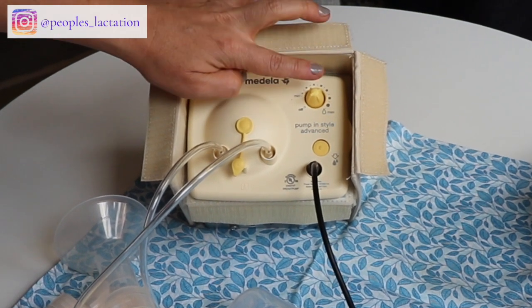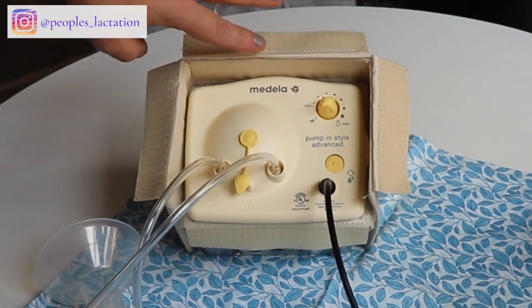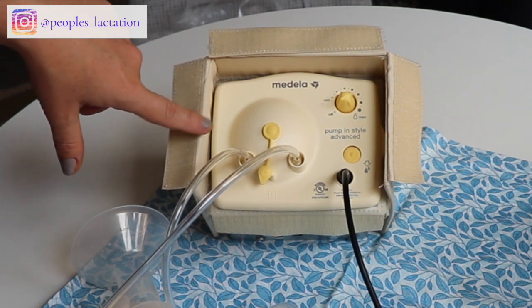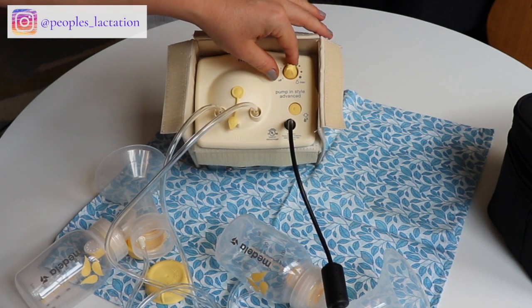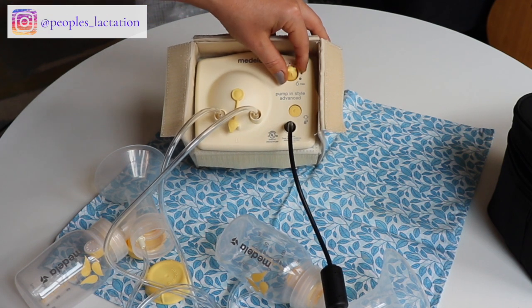On the Medela Pump and Style, you have your letdown button here and a single knob that controls the speed and suction. When you start out, you want to start in the letdown phase — this pump automatically starts in the letdown phase. To turn the pump on, turn the knob to the minimum and you're going to start to hear it do the quick initial sucks of the letdown phase.